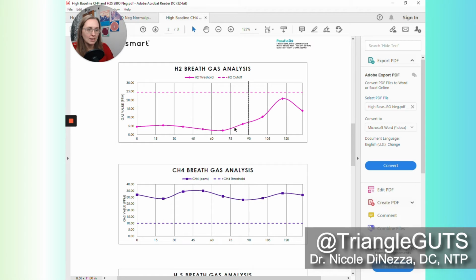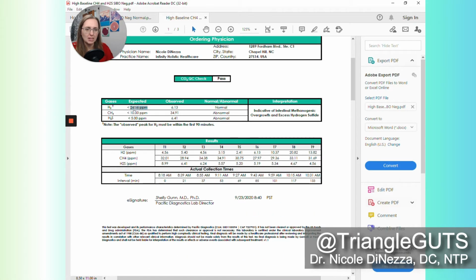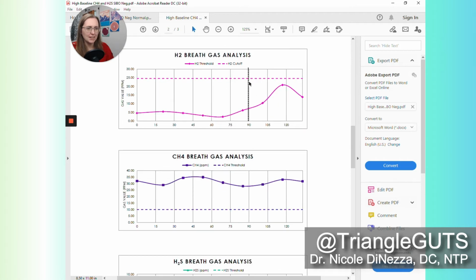Yet again, here's a really nice, clear, negative SIBO breath test from the hydrogen perspective. You can see that hydrogen doesn't even cross the threshold until after the 90-minute mark, and it's nowhere near it here. You can see that they put the dotted line for the H2 cutoff up closer to 25 parts per million. And I've observed with this particular lab that they kind of play with their ranges a little bit. So one day I'll order this and it's 20 parts per million, and the next it's 24.56, which is very peculiar. But you could see generally similar, and it's not even getting close to that threshold here. So that is clearly negative.